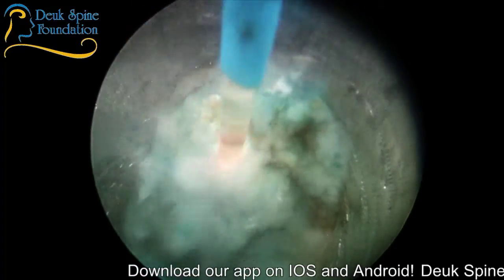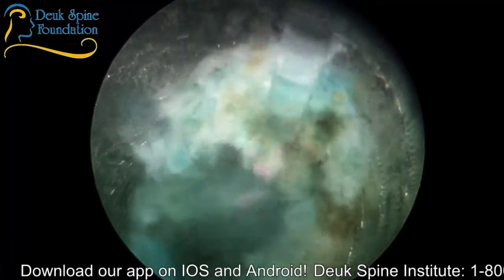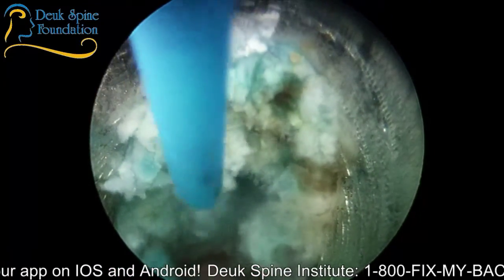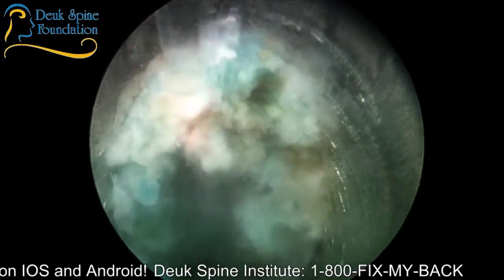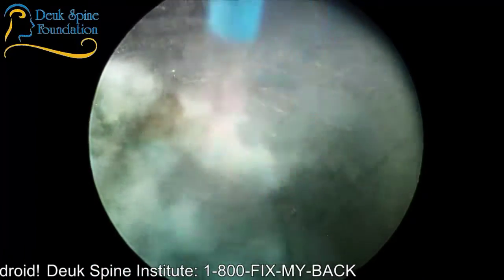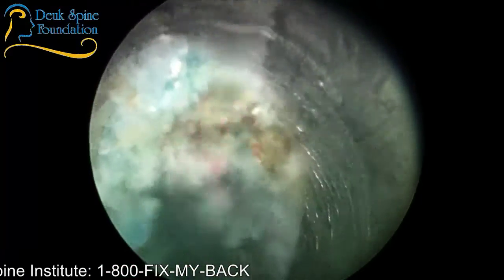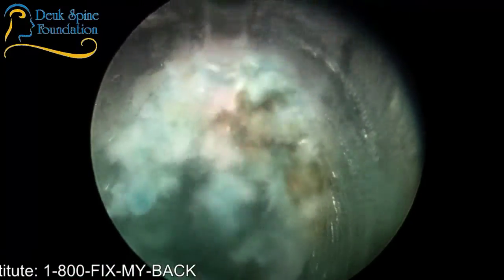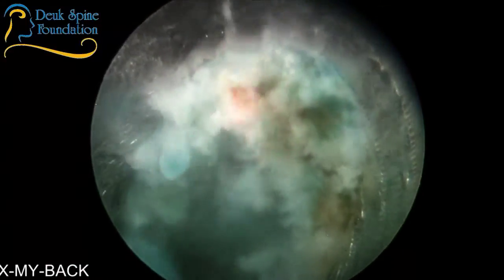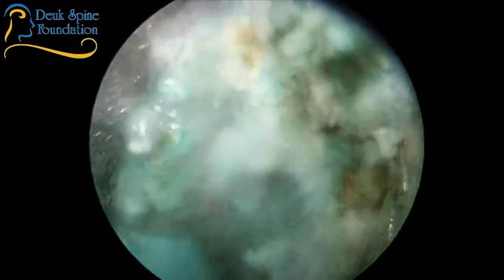All right, for those of you watching the surgery, I'll just commentate. We do these live so you can ask questions while I'm doing the surgery. You can ask me, like, what's that? Why do you do that? You can ask me about socioeconomic issues in healthcare. You can ask me about insurance, and you can ask me about spinal procedures and diagnostic tests. We get a lot of really good questions from our groups over the years. Some of them come up over and over again, but that's okay. It's good to hear some things multiple times.